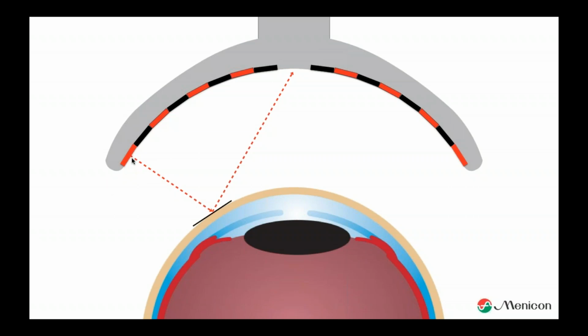And you can imagine that the flatter the eye is, the more this tangent point will be in the periphery. But with a steeper eye, you will reach that specific tangent, which corresponds with this tangent over here, earlier than with a flatter eye. So the curvature of a cornea is also responsible for the size you actually measure with your topographer.